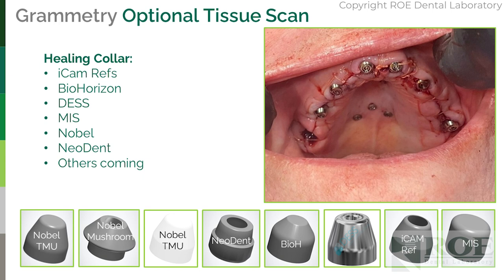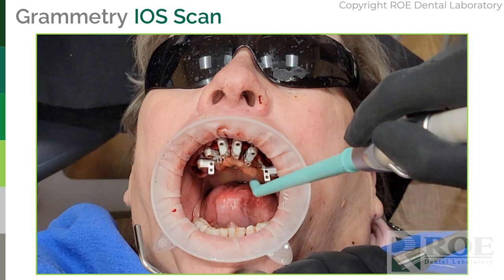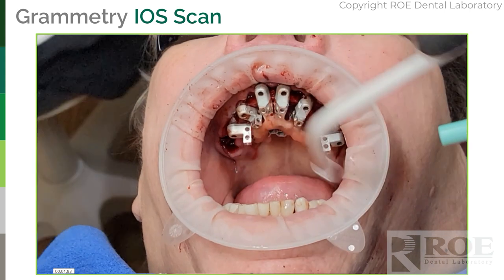If you don't have the healing collars, for some reason, on the day of surgery, or there's some other reason that you want to scan the OptiSplint in the mouth, that's fine. That's how the product has been used for the past year in the mouth. Let me just quickly go through this.